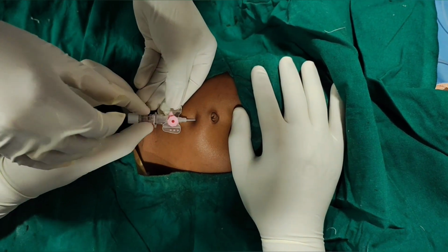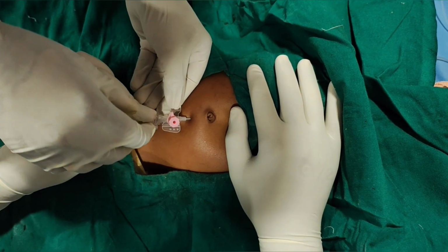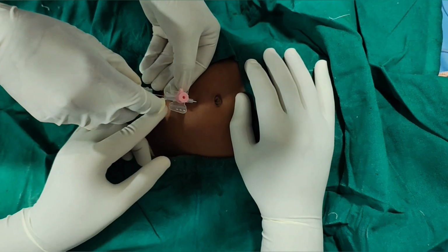After insertion of the IV cannula in the infraumbilical area, now we have to connect the PD fluid, and we have to instill the PD fluid into the peritoneum.